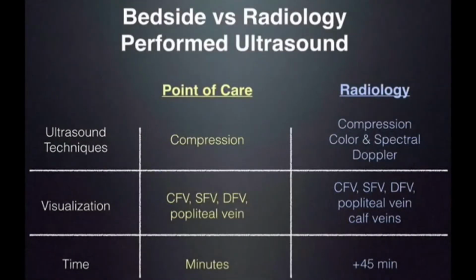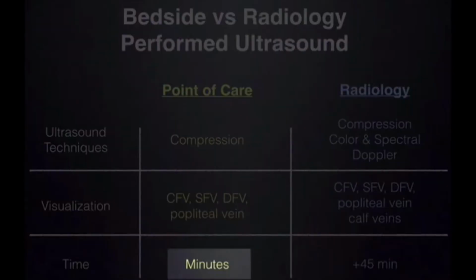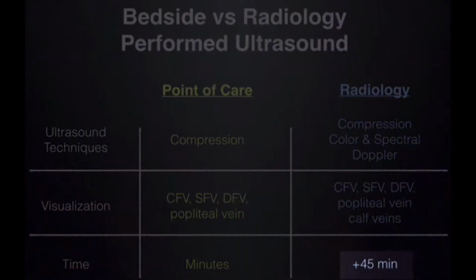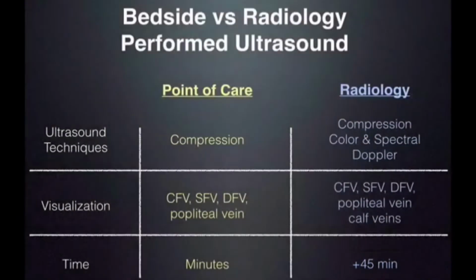And then the time: there's a big difference. The emergency physician or bedside ultrasound only takes minutes. Once you get well at doing it, maybe 2 or 3 minutes, while sending a patient up to radiology to have an ultrasound performed can take 45 minutes to up to an hour and a half sometimes, depending on the availability.